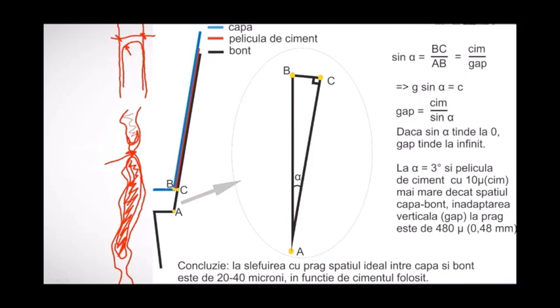If you do knife edge preparation, you can't do that. It has to fit perfectly. The shoulder preparation, you can have larger copings because the thickness of the shoulder would compensate for it. But if you have knife edge preparation, it has to fit perfectly around the tooth, and there you have to be much more precise than in a shoulder preparation with the gap for the cement.